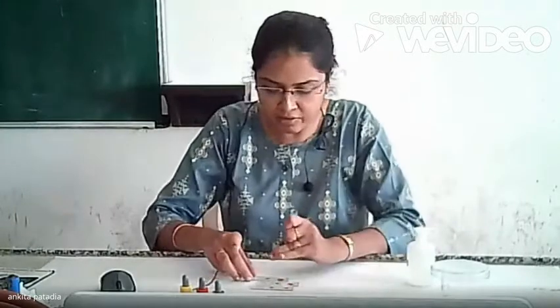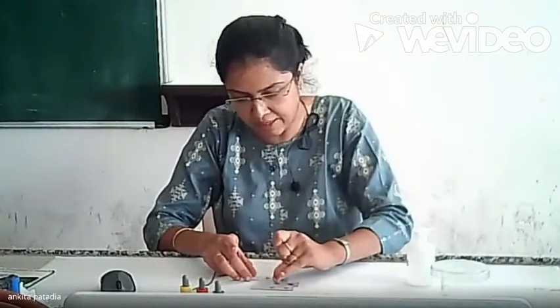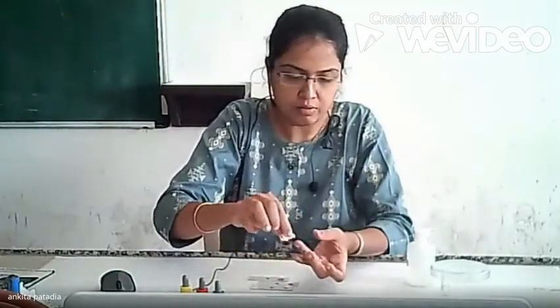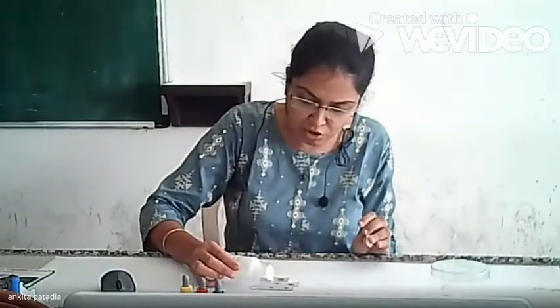We have to collect 3 drops of blood in the respective labeled circles. Now we are adding 1 drop of normal saline to each drop.